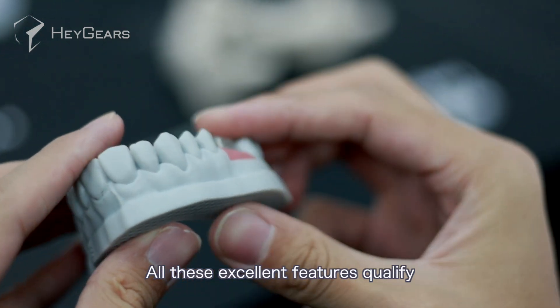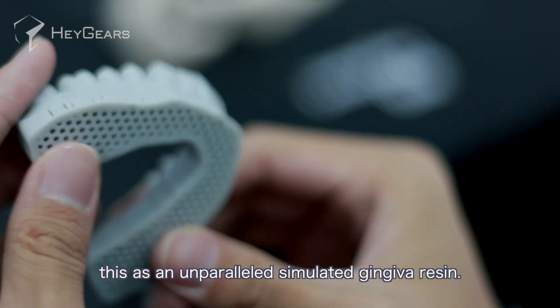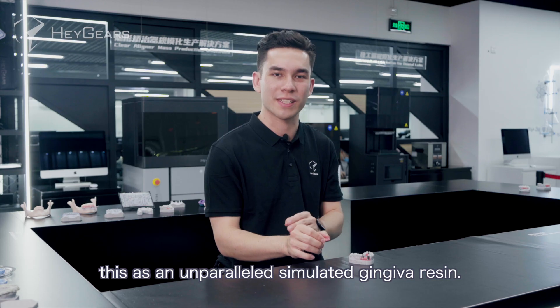All these excellent features qualify this as an unparalleled simulated gingiva resin.